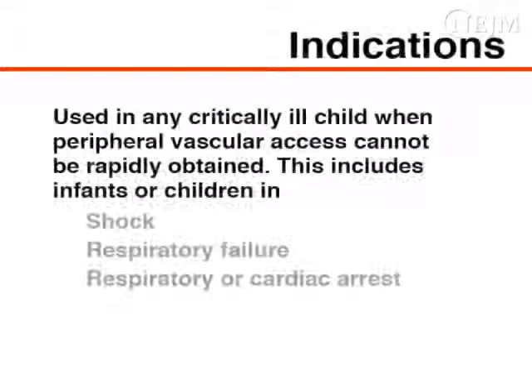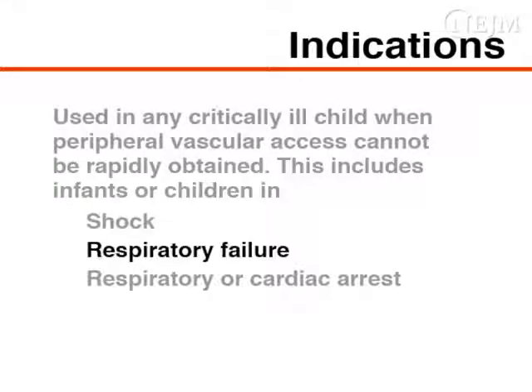Intraosseous cannulation is indicated when peripheral vascular access cannot be rapidly obtained in any critically ill infant or child, including those in shock, respiratory failure, or respiratory or cardiac arrest.